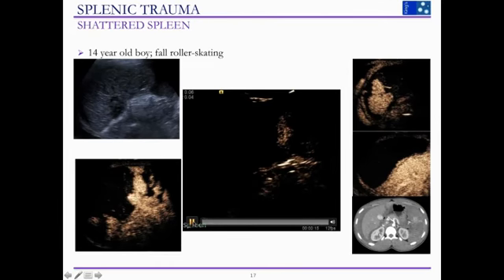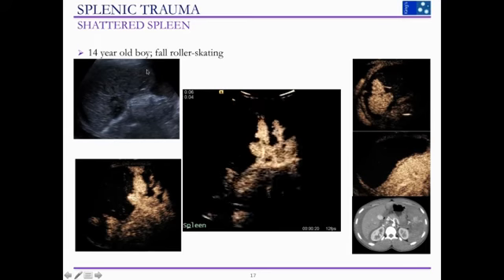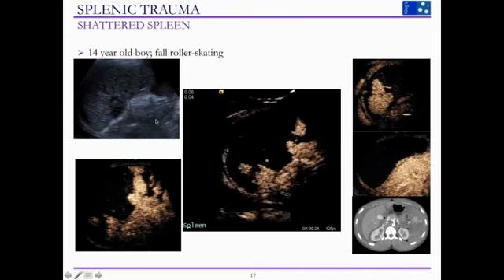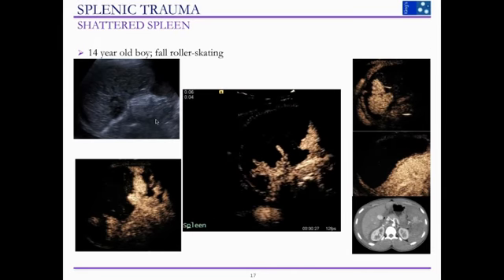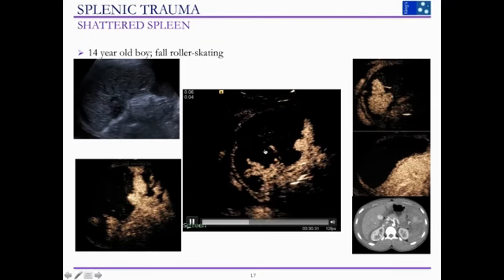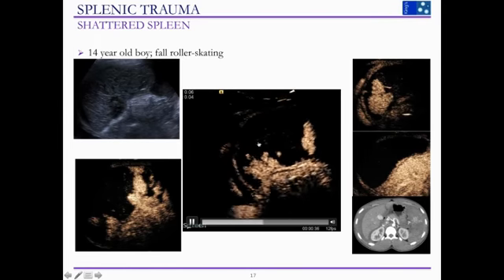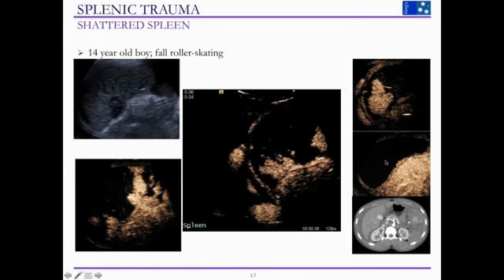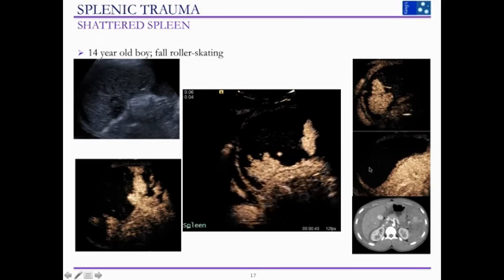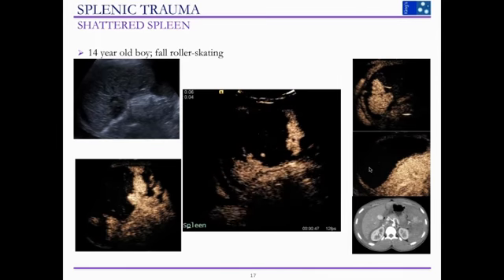This is another boy who fell while skating. On B-mode ultrasound the spleen is clearly very abnormal, but the question is how much of this tissue is actually viable — is this a completely devascularized spleen? On the CEUS video, there is hardly any enhancement post-injection of contrast. This was a nearly completely devascularized spleen, and the patient subsequently underwent splenectomy.